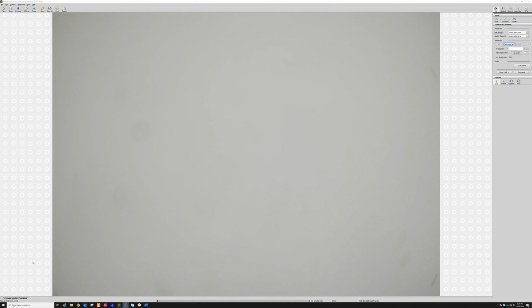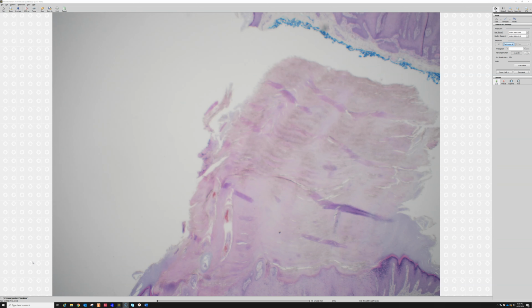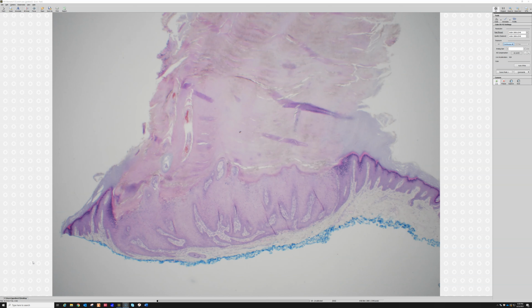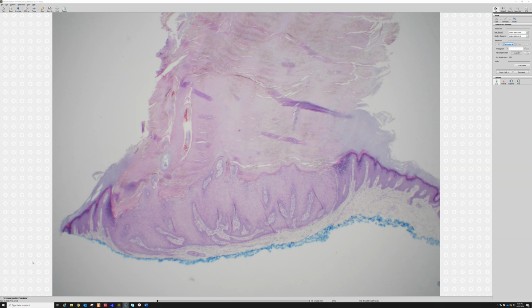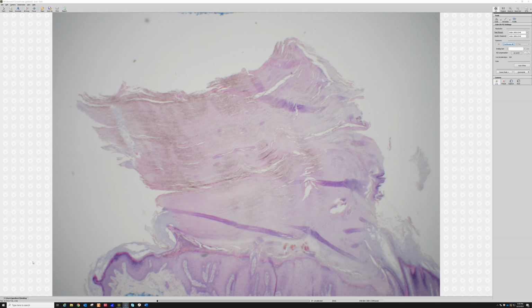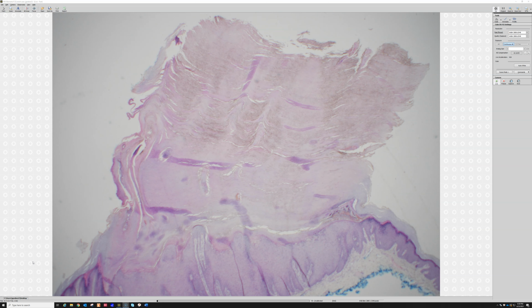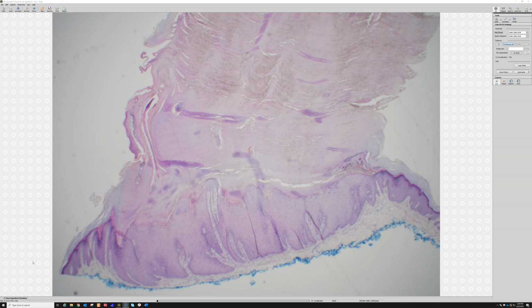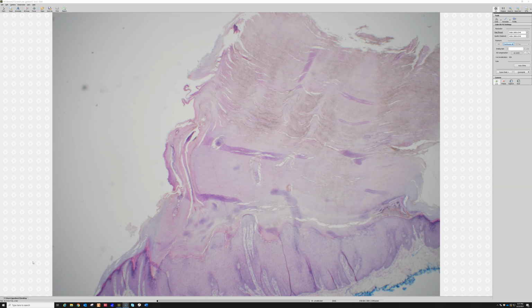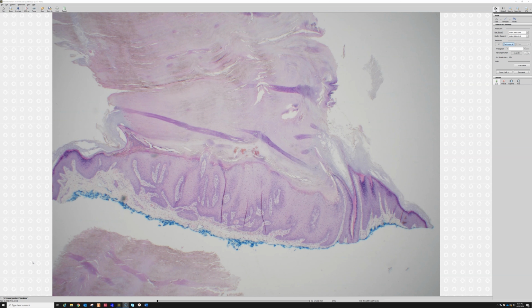Now, a new topic to discuss here on this one. Now this looks good for a wart. It's got all the stuff we talked about. It's got a massive thick layer of keratin on the top, so much that this is what we would probably call clinically a cutaneous horn. And I have a whole video about cutaneous horn and the different things that can make it. It can be made by squamous cell carcinomas, actinic keratoses, verruca, sometimes even seborrheic keratosis and other things.